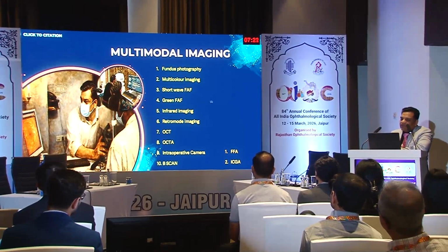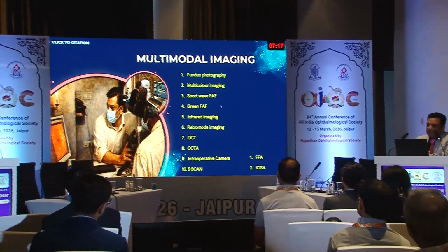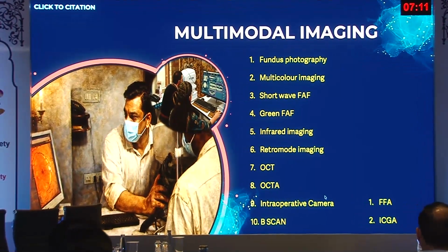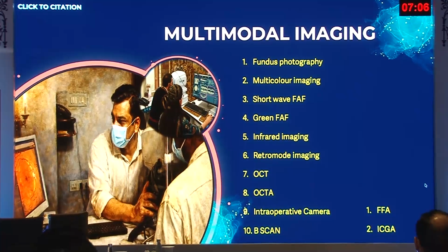Now this multimodal imaging is exhaustive actually. There's a lot of things to discuss. Fundus photography, there is multicolor imaging, shortwave autofluorescence, green, infrared imaging, retro mode, which is one of the features of the NIDEK Mirante machine, the OCT angiography, which are all non-invasive modalities. And then you have the invasive modalities, which is the FFA and the ICG angiography.